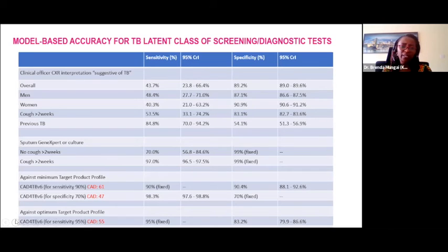Remember, I told you we did some modeling just to check sensitivity, beyond what we took as sputum, and to answer our question of whether CAD could really be a tool used in community-based screening.